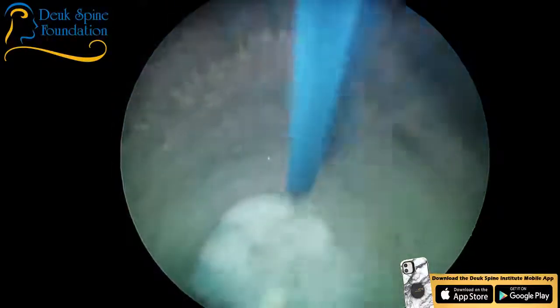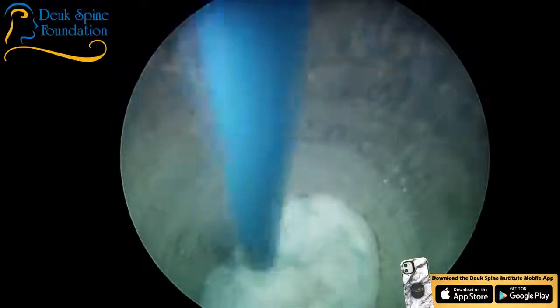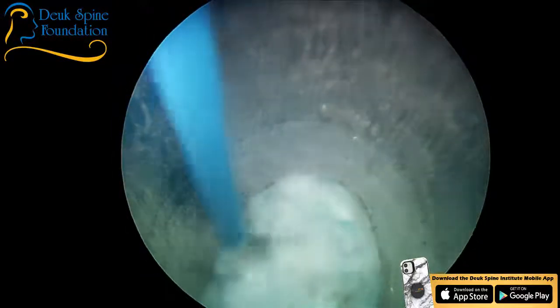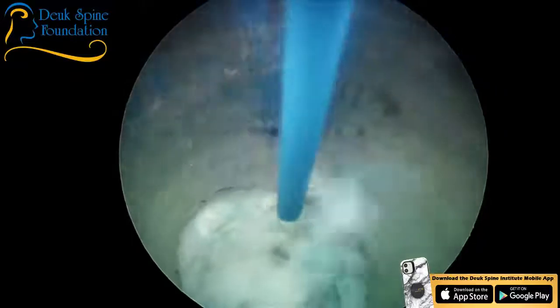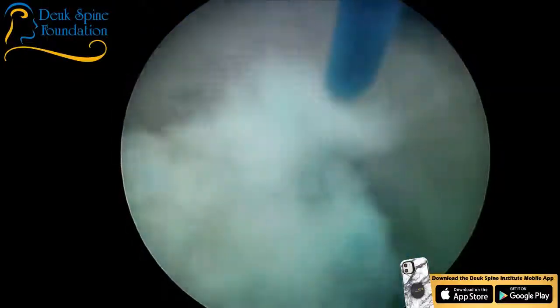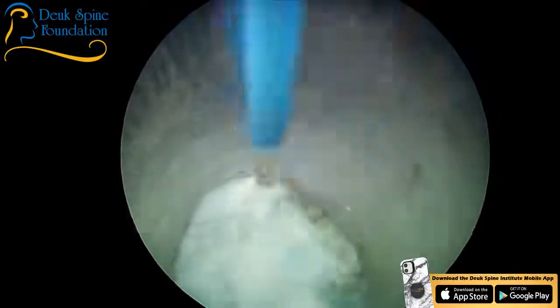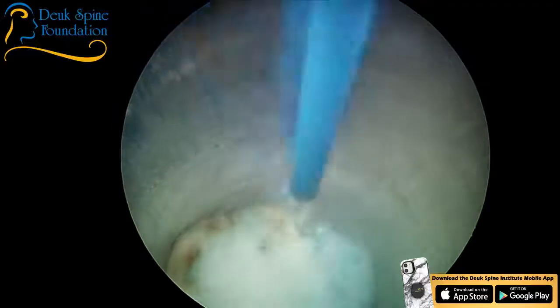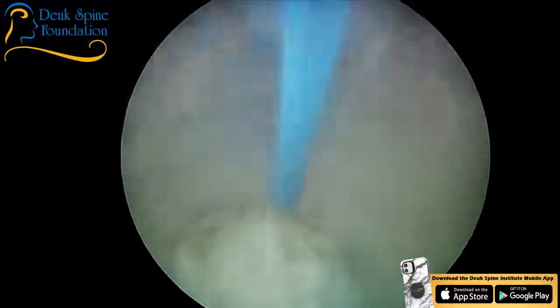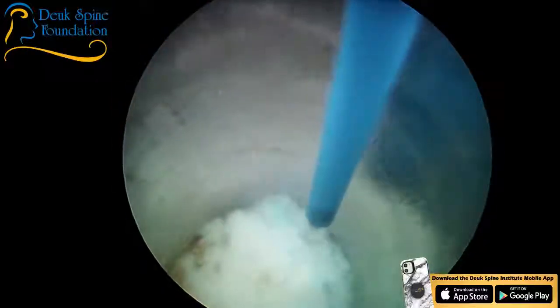Louise is observant — you can predict what I'm going to do based on that monitor once you learn my steps. I do the same thing over and over again. Good surgeons are creatures of habit. They develop a process for a specific surgery — literally hundreds of steps — that they perform every single time. Surgeons without those processes are like taking a boat out in a storm every time you operate.